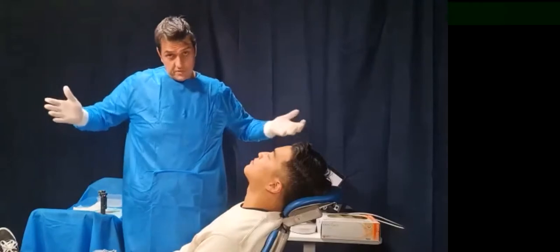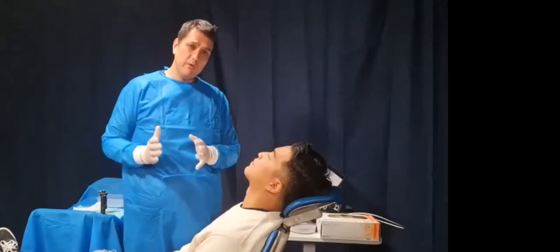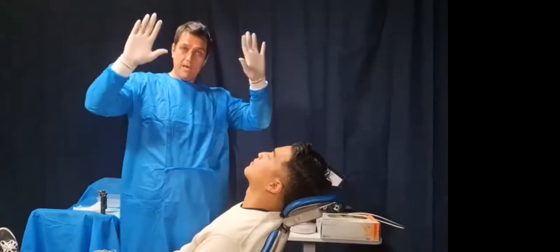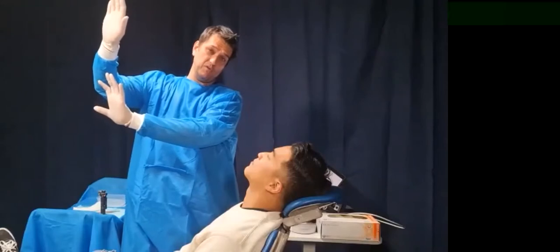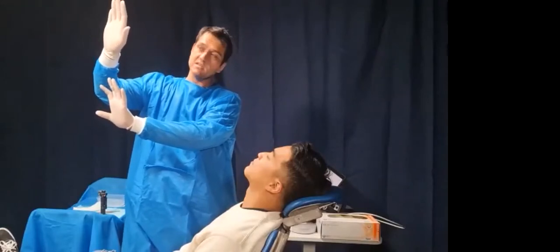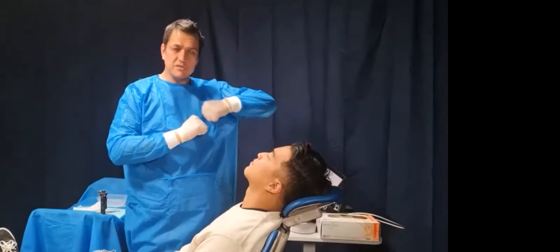Now, why am I doing that? For obvious reasons. The scanners that we can use today record occlusions by picture mapping the images. They only picture map the buccal surfaces because that's really all you can access. All they're looking for is a similarity so that they can puzzle this picture together.